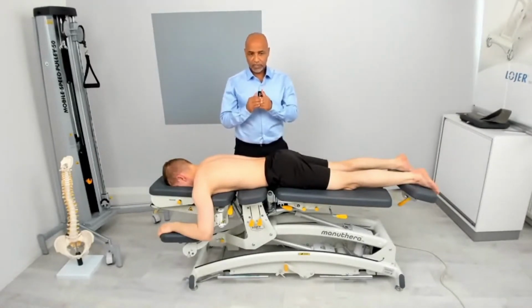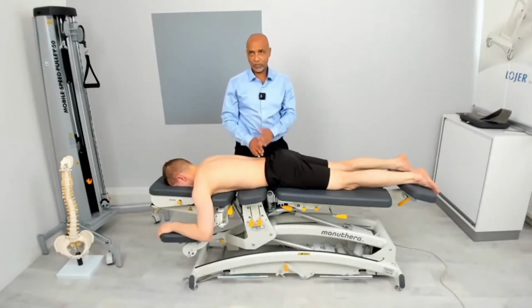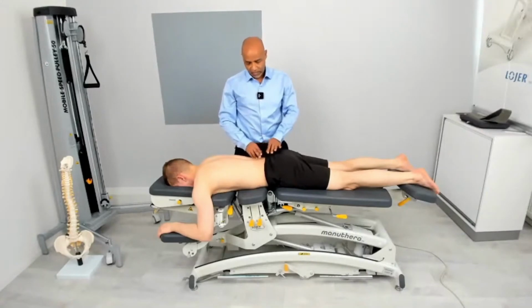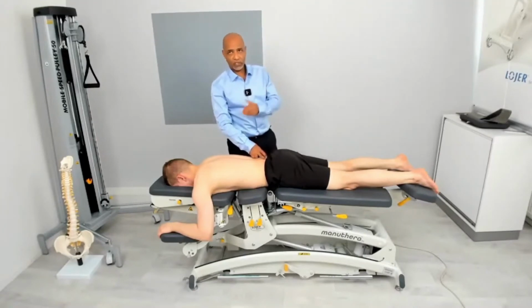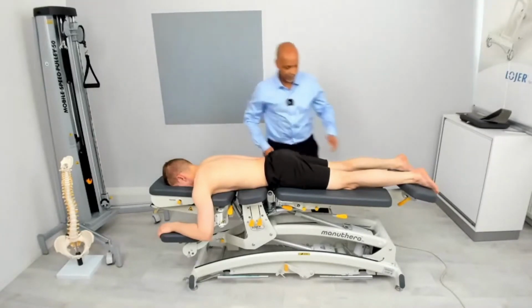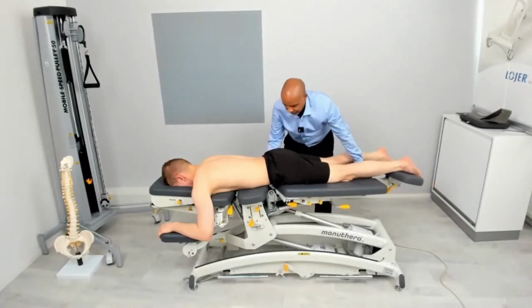It's possible that one joint is very healthy and the other one is not, because sometimes you have those particular cases. So I prefer that if the patient has one particular joint which is healthy and another one is not, or both are not very healthy, I can take this particular lever to lateral flexion.